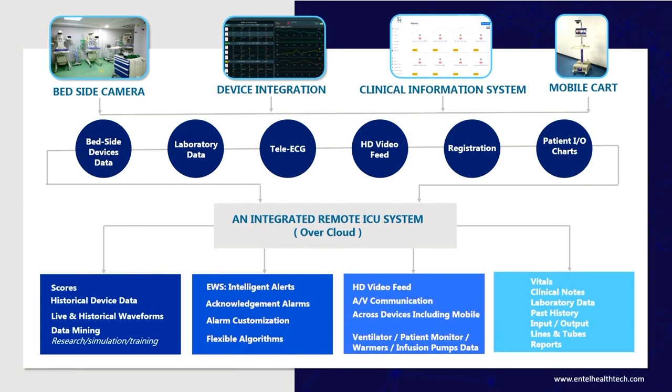Now, what do we install to make the ICU smart? There are basically 4 components. One is integration. All integratable monitors, whatever the instruments in the ICU, whether it is a multi-para monitor, infusion pump, syringe pump, ventilator, even some DVT pumps are integratable. Whatever is integratable, we have to integrate. So all data comes to your command center.